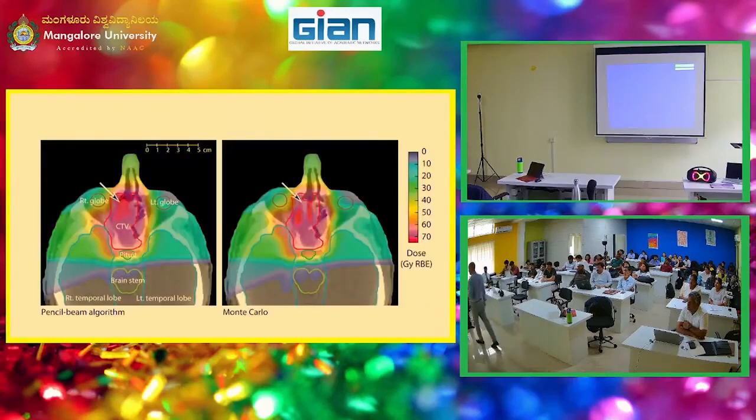So let me give you an example of why we're doing this. This is a representation of where we want to target our radiation, and this is your dose. Gy here is a measure for how much dose is received, whatever the tissue is receiving. It's always good when they say that, because what you emit and what you receive are different. So it's how much is received by the tissue. And obviously here, as you can see, this is the area where there's the most dose.